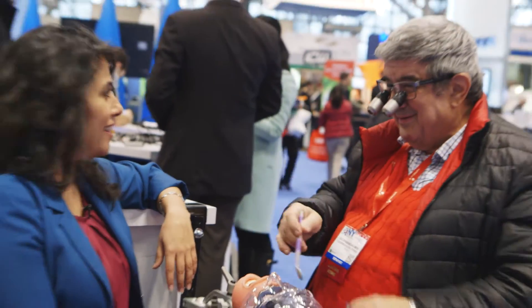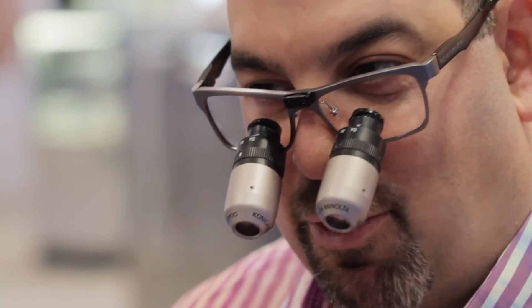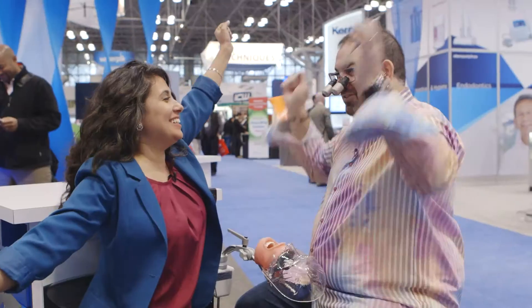Could you see yourself using the Eye Zoom? Yeah, yes, why not? It definitely is a wow. It's fantastic, I love it. I like it, it's really great. I have got to get a pair of these. I don't really show my emotion that much, but I'm really excited about the Oroscopic Eye Zoom.